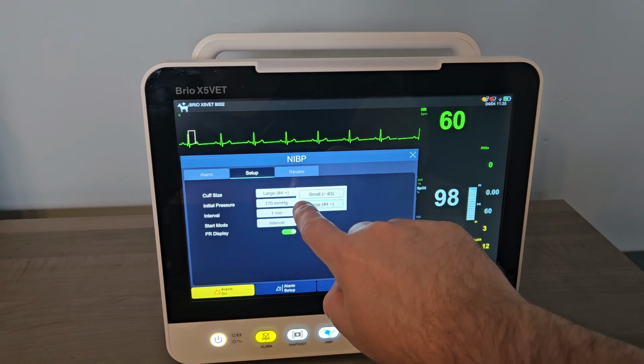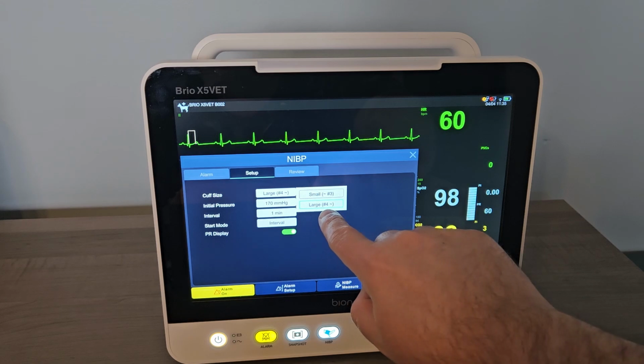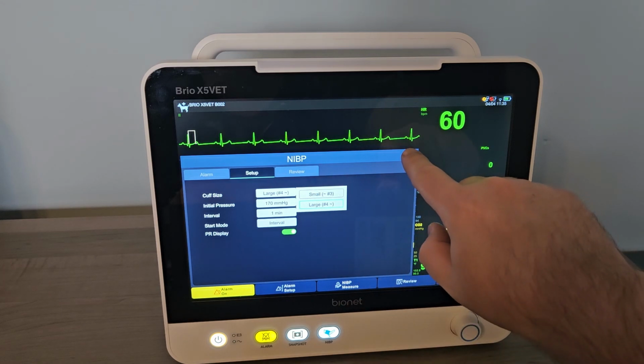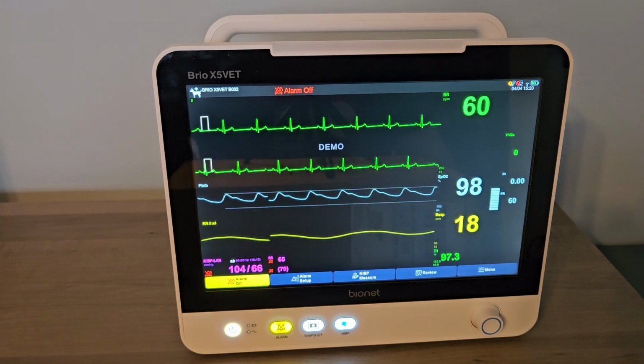If using a size 1 through 3 cuff, choose Small, and select Large for cuffs that are size 4 and up. If you have purchased an end-tidal CO2 sensor with your monitor, you will need to ensure that the parameter is turned on before reading.